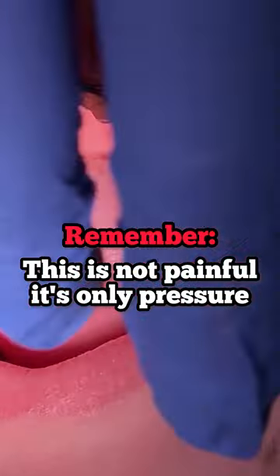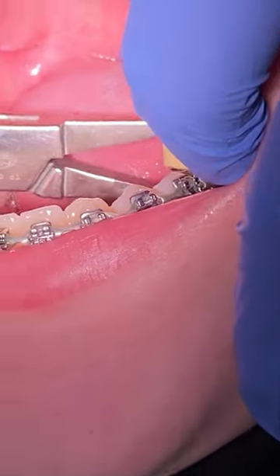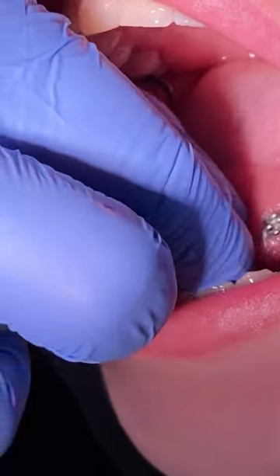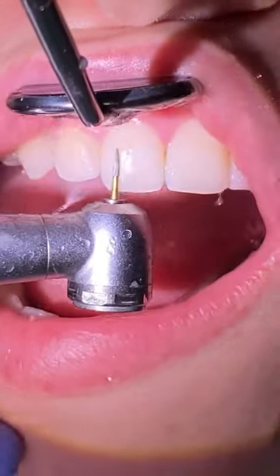This is especially important for those top teeth, as they're a little bit more sensitive and mobile because they have one root. Here we're using our band remover tool as we're removing the molar bands and taking off the rest of the braces. Then we're going to go ahead and polish and remove any of the glue residue left on the teeth.